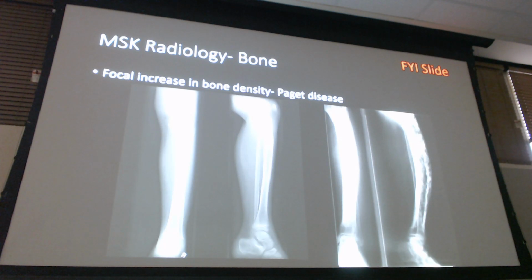So I'm not needing you guys to become experts in pediatric radiology, except for Salter-Harris fractures, and we'll spend quite a bit of time on that, looking at those, because you can't miss those things. But growth plates will tell you adult or peds.